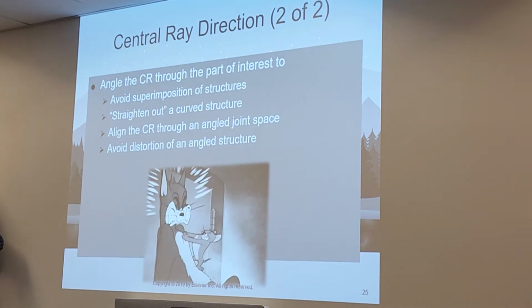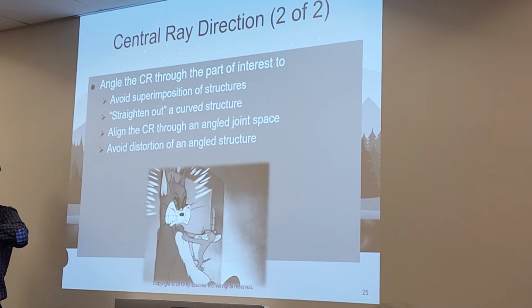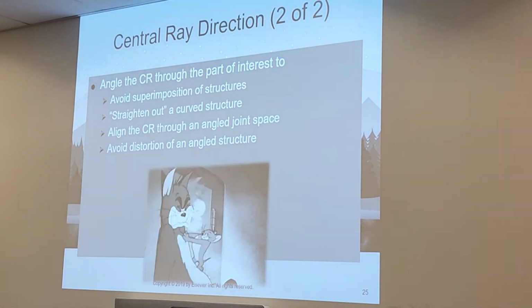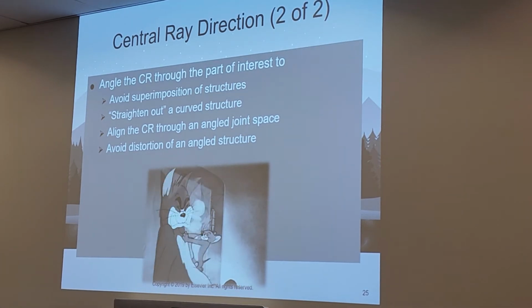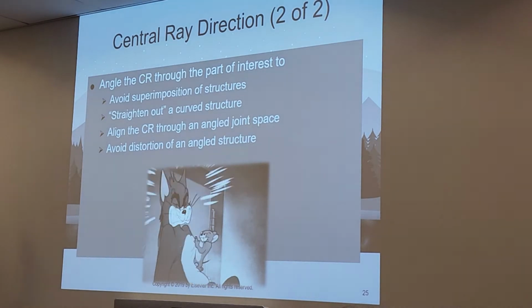And the only way to see those pathologies is to make sure that we are properly positioned. So if you don't see the gap, then maybe the patient has arthritis. Right? The joint space has worn away. You don't want to be missing the joint space and be unsure whether it's arthritis or I just positioned the patient poorly. So that is why we angle.